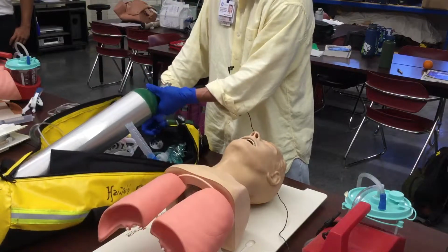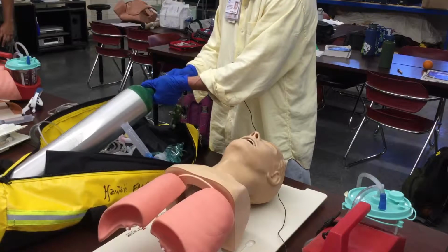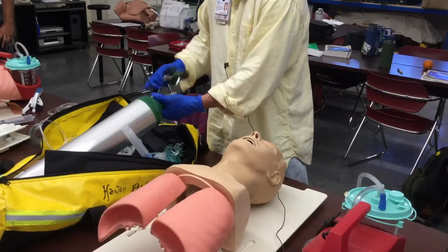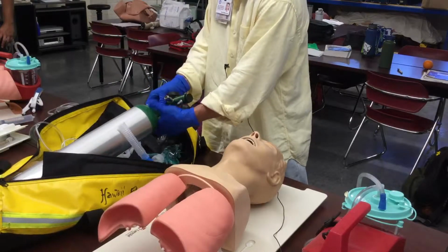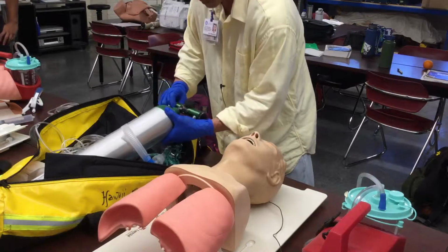Now to prepare the tank, I want to make sure that the opening is clear, and I'm going to open this up real quick to just purge some of the dust that might be in there. No flames, no petroleum-based products or lubricants. So I'm getting ready to administer oxygen.